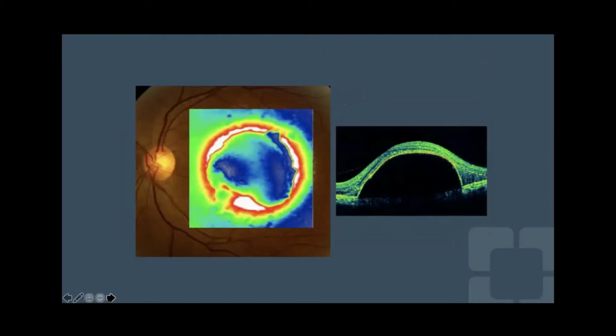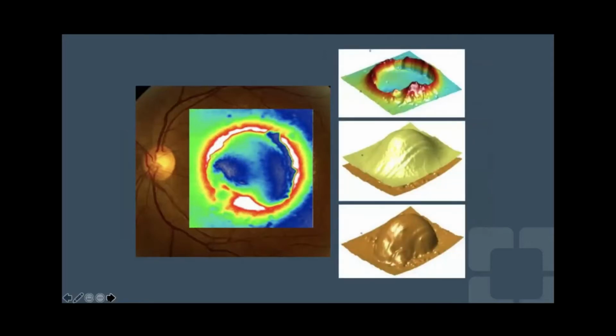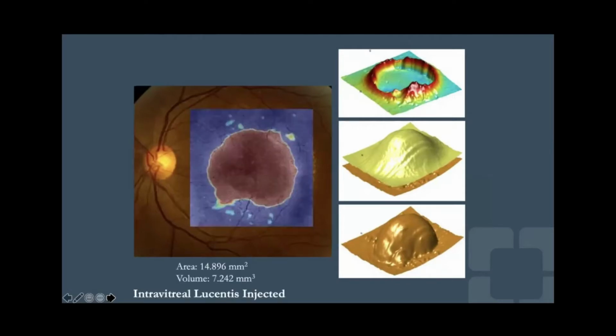It's always difficult, I find, when we treat patients with anti-VEGF agents and determine treatment response, because these are so elevated and so hard to determine if they are getting volumetrically better or not. But that's where, again, this RPE elevation software comes into play, where I can really look at that distortion of the RPE slab and see how that changes over time. And what you can see after I gave one Lucentis injection here is a baseline area and volume, which is outputted from the machine.